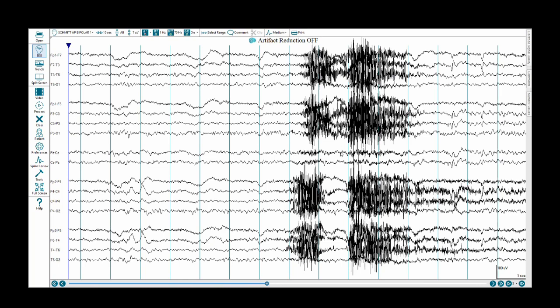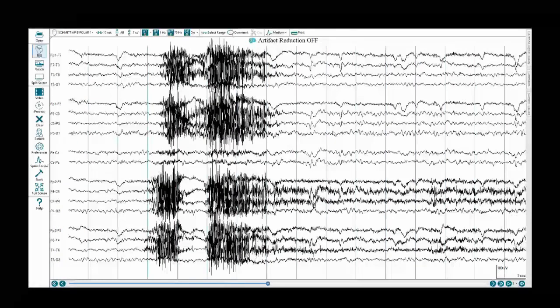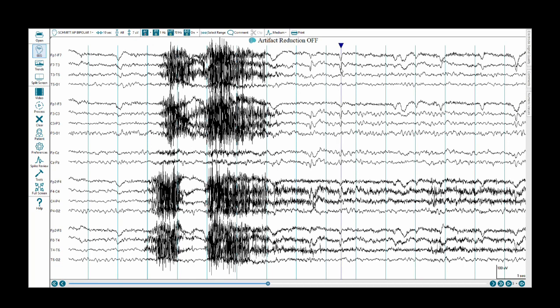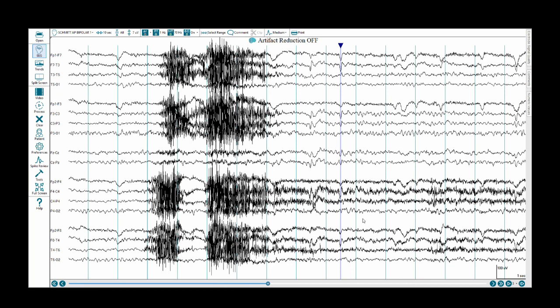This unusual polarity distribution is due to the frontal dipole being so strong, and how it is affecting the electrodes in the context of how they are arranged in this bipolar format over the left hemisphere. The reason for the downward deflection in the F7 T3 channel is not the reason for the downward deflection in the F8 T4 channel. In the F8 T4 channel, the reason for the downward deflection is that T4 is the complicit electrode. It's more negative than F8 because it's near the region where the discharge is being picked up on the surface. If we look at the F7 T3 channel, there is a downward deflection because F7 is actually recording a positive voltage at that moment in time because of the dipole.